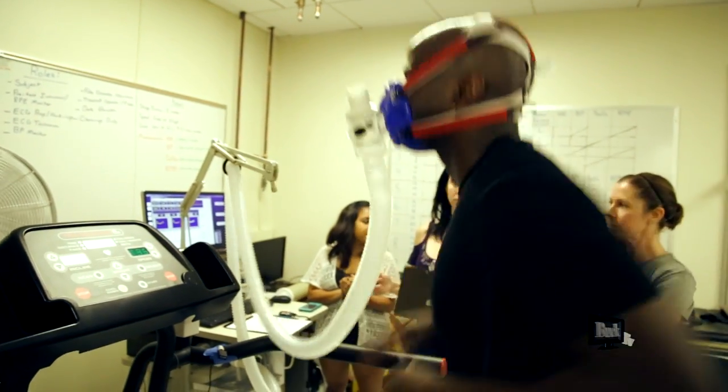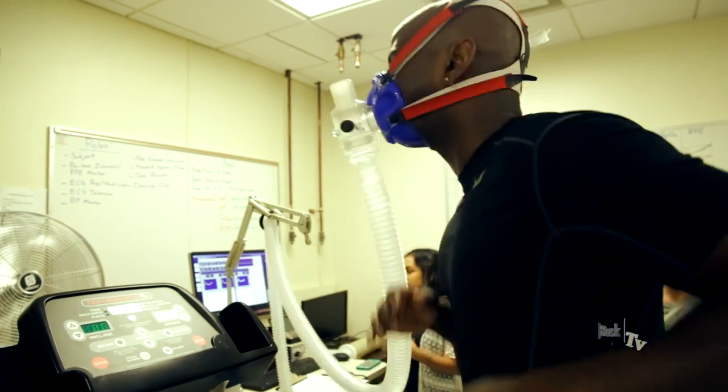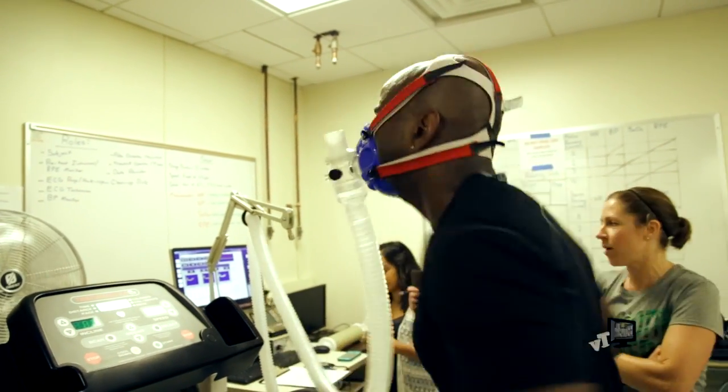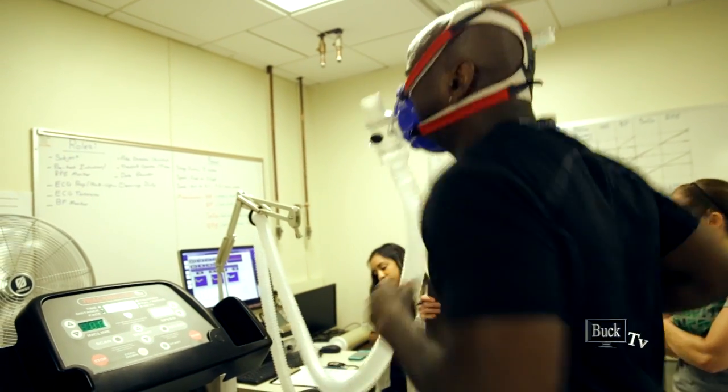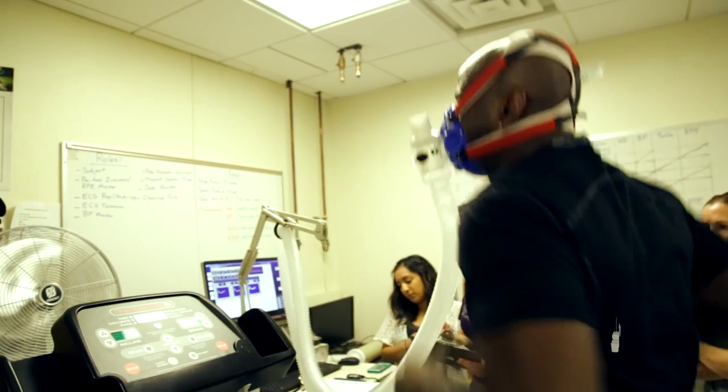Come on, Marshall, you got it. Just keep pushing yourself. VO2 is climbing. Remember, that's the goal today. You got to push. Every minute you push through, you get that VO2 a little higher. Hang in there, Marshall. Come on, stay relaxed. One more minute.